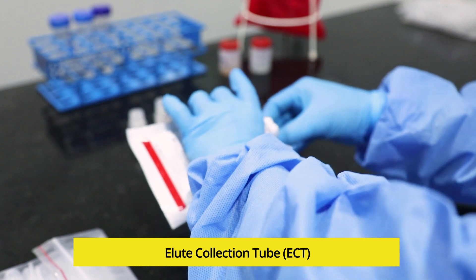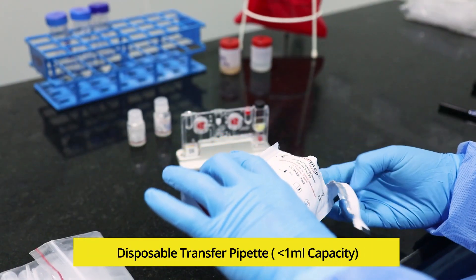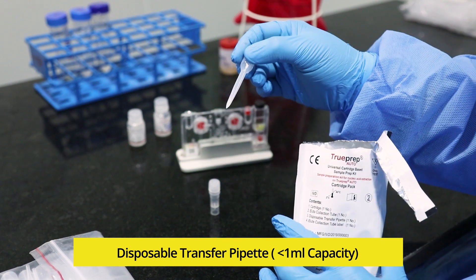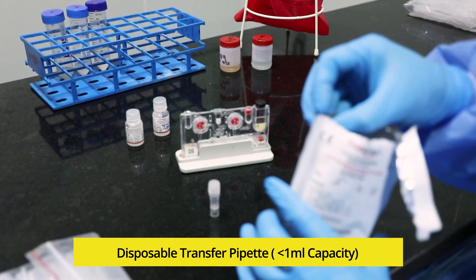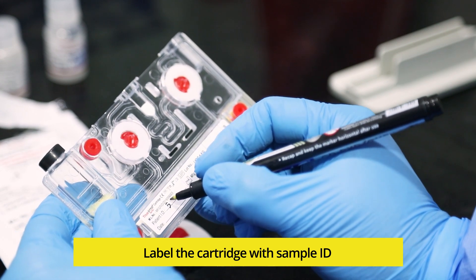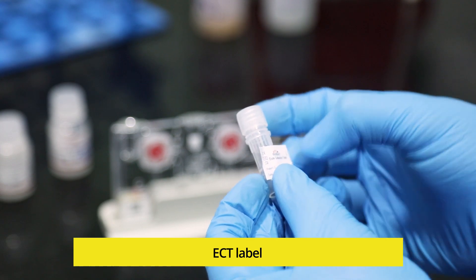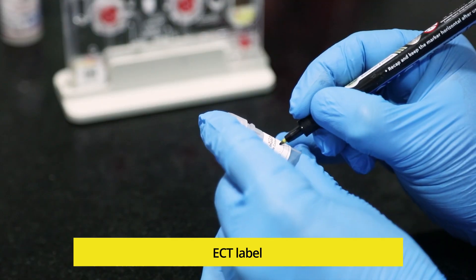Take out the elute collection tube and keep it aside for later use. Check if the transfer pipette is provided in the pouch and keep it inside the pouch itself. Label the cartridge with sample ID using a marker pen. Also label the elute collection tube with sample ID using the label sticker provided in the pouch.